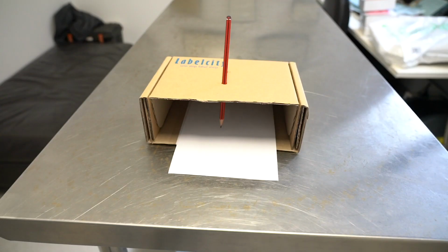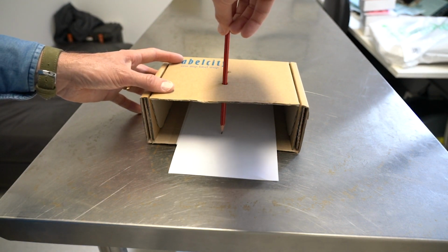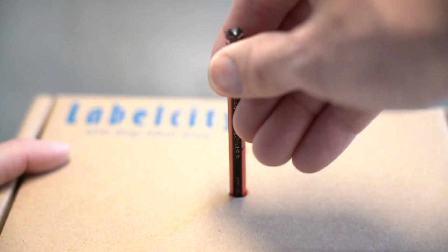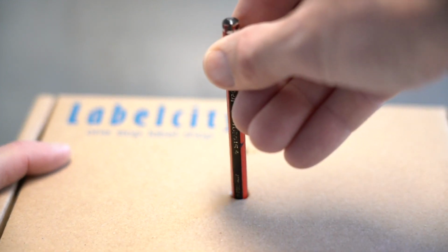So with this demonstration, I've taken a pencil and put it through a hole in the box. And what we'll find is that the movements that are made outside the box are reversed and upside down on the inside of the box. So if I move the pencil on the outside of the box in the shape of an upright and correctly oriented letter R, you can see that on the inside of the box, the R is being formed upside down and reversed.